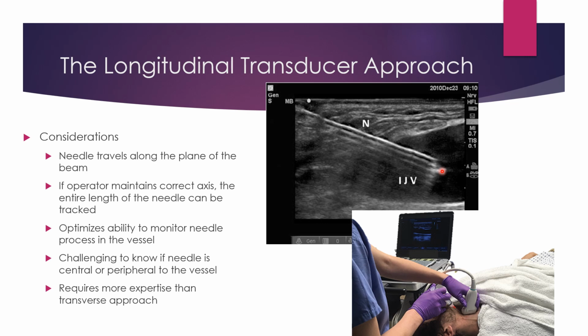Like when you saw in transverse, you knew you were in the center of the vessel. So this can be a little bit more difficult in the longitudinal approach to tell if you're truly in the vessel, and a little harder to track your needle. But once you get efficient at this, you can actually track the whole needle, and so some practitioners really like this once they become more advanced.